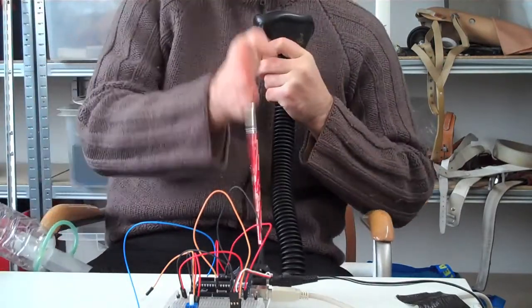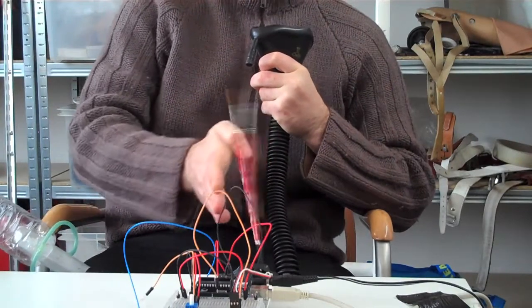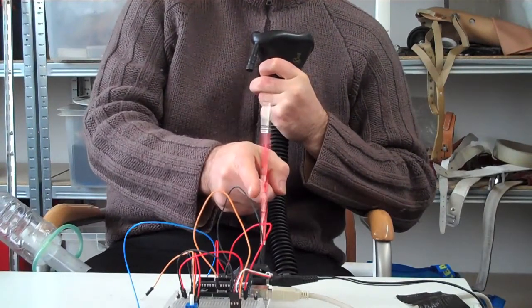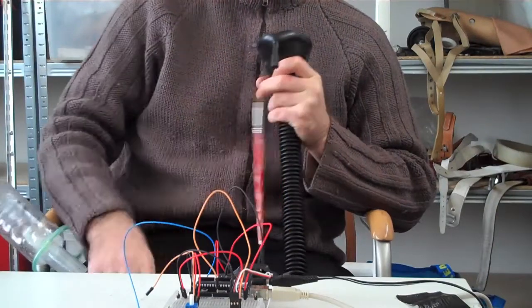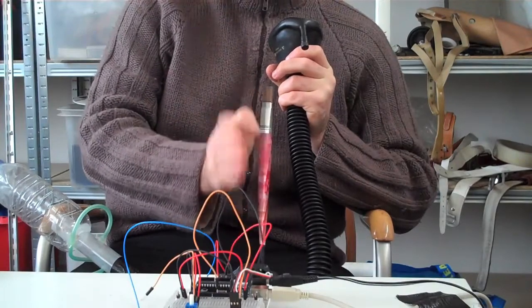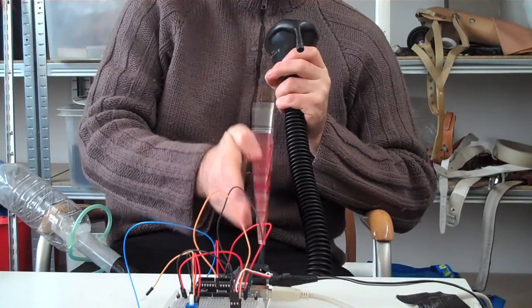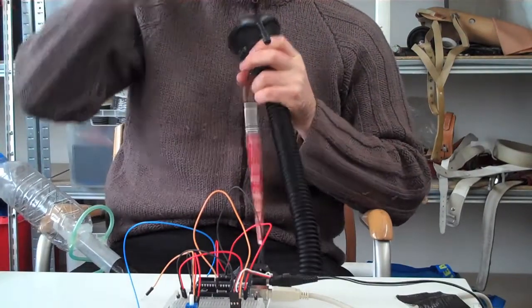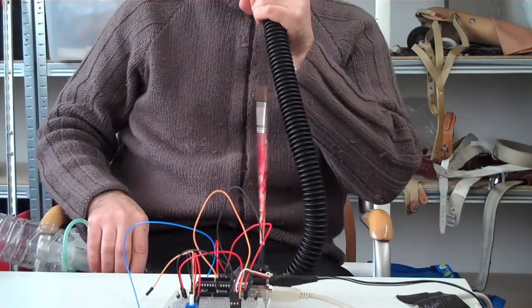So this servo, which has got a paintbrush attached to it, is effectively a gauge, being used as a kind of swingometer. It's actually showing flow rate, not actual volume. I'll show you when I inhale and exhale gently over a period of time.